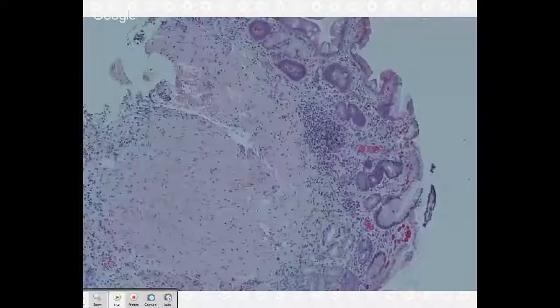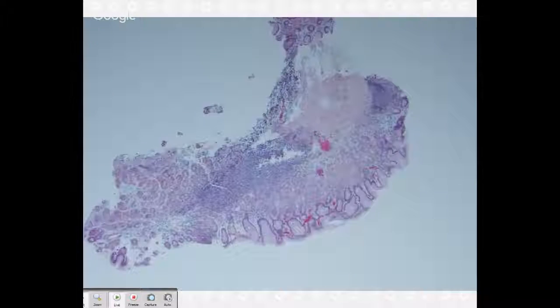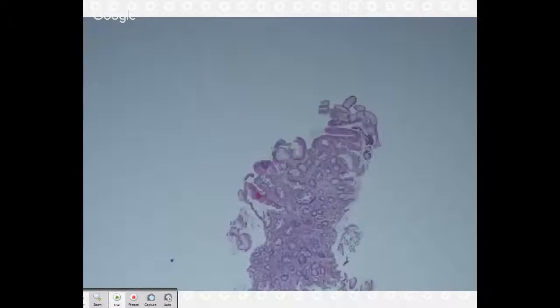And so you can see that. And then, let's see, I was on track to tell you one more thing. I have another slide, though. I brought some other examples so that you can see. So your histamine cells rev up, and so you can have ECL cell-like hyperplasia.